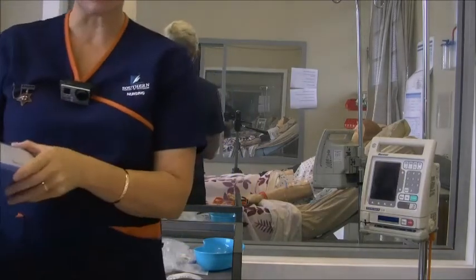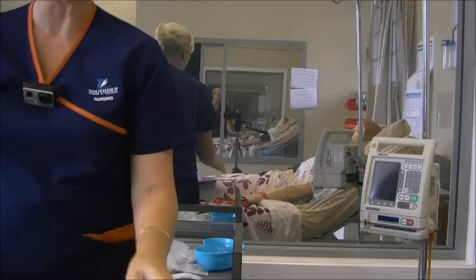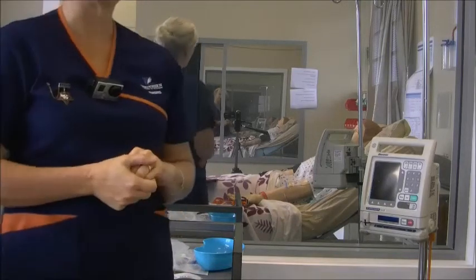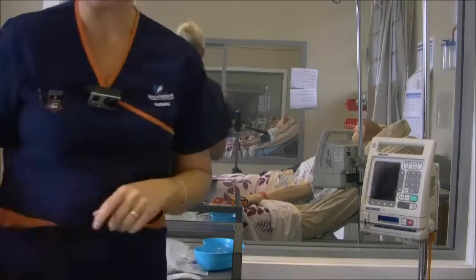record, which has the IV instructions in it. So you'll need to work this out when you get your orders, but for this patient he's having a litre of normal saline over 8 hours. So I've worked that out to be 125 mils per hour, which is what I'm going to put up.